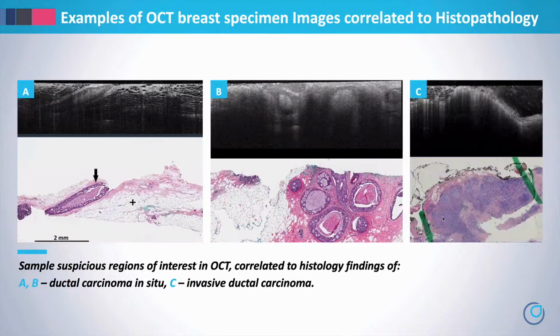If we start to look again at DCIS and invasive ductal carcinoma in these figures, part A shows us DCIS at this arrow in H&E, seen very clearly on OCT. And while the signal is reminiscent of ultrasound, this high resolution almost takes you down to the level of histology. Part B also shows more DCIS. We can see those abnormal glandular structures here in the OCT data stack.